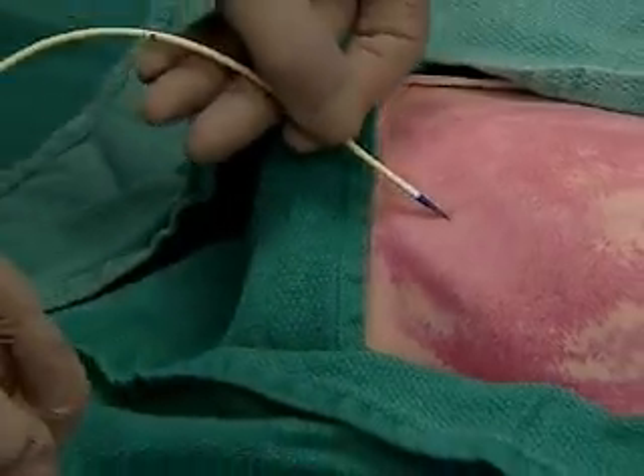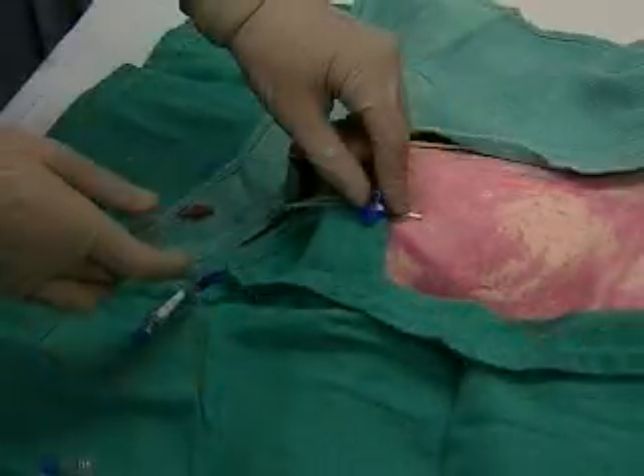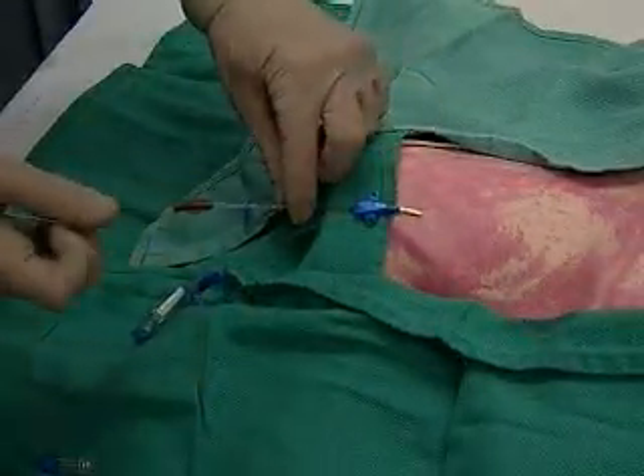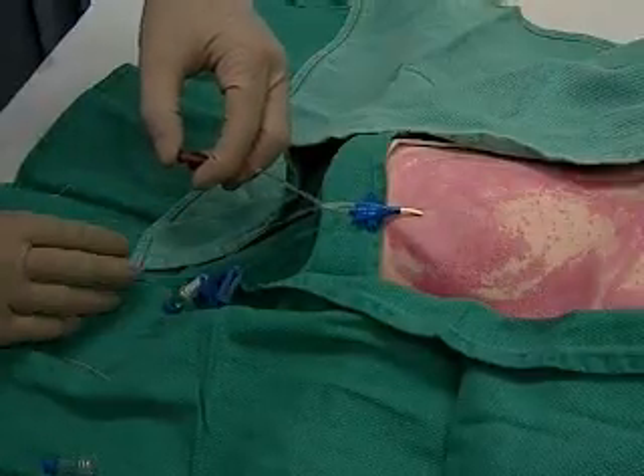Grab it and advance the catheter through the skin, then remove the wire getting ready to cap the port with your finger, and put the hub back on.